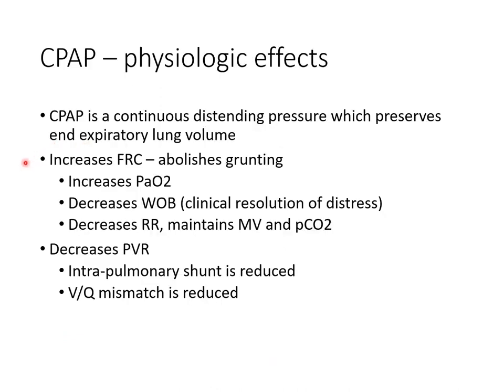So what are the other physiological effects? One thing is that it increases FRC, it abolishes grunting, increases the PaO2, work of breathing is reduced, tachypnea is reduced, it maintains minute volume, and the PCO2s are better. It also decreases pulmonary vascular resistance by improving hypoxemia, and therefore the VQ mismatch is also reduced.